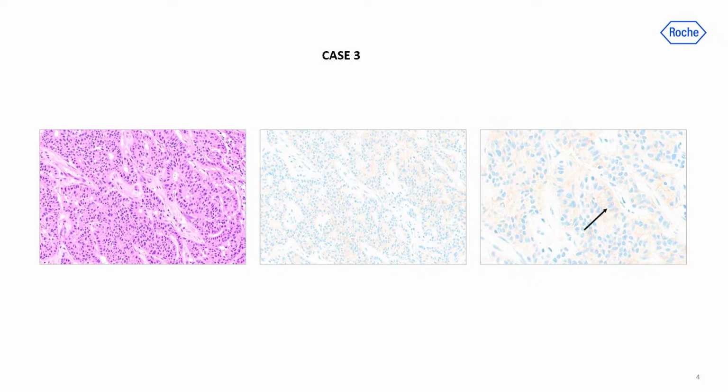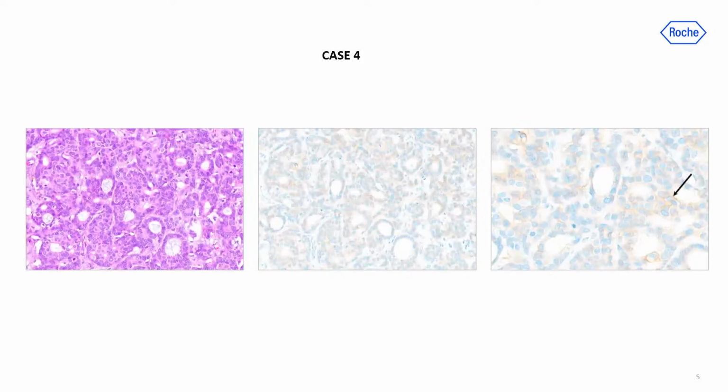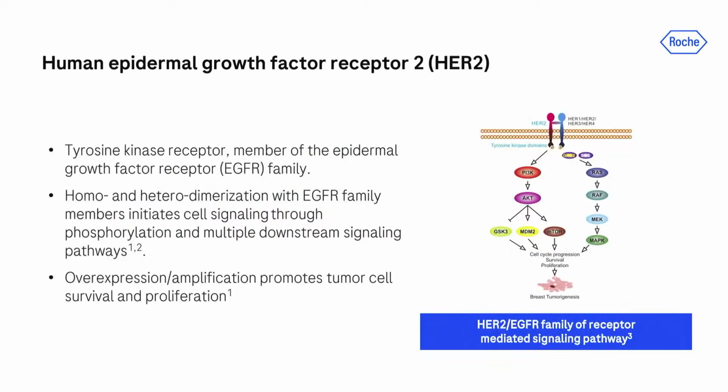This is case 3. And this is the last case, case 4. Okay, so we'll come back to these at the end of the presentation.